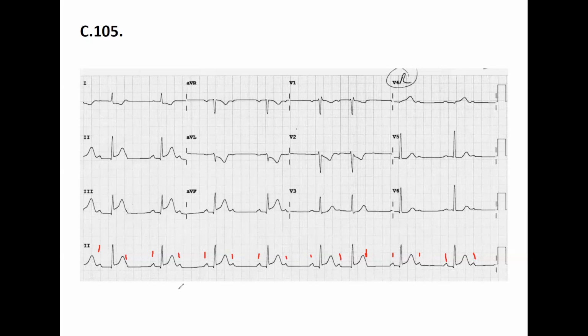Um, I'm not sure because I didn't notice this. I thought it was an ST elevation, which is why I was unsure. That's okay, the ST elevation is fine.